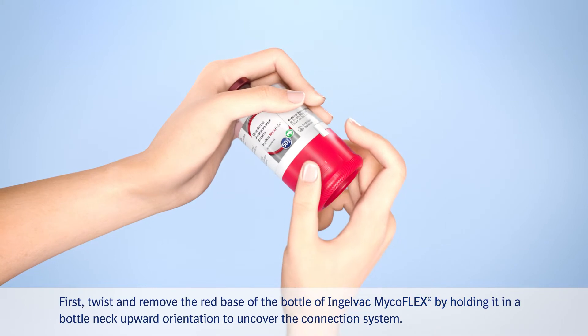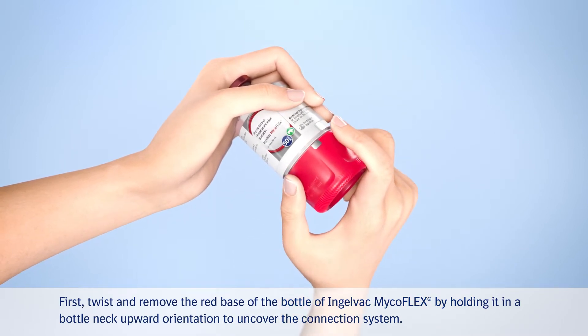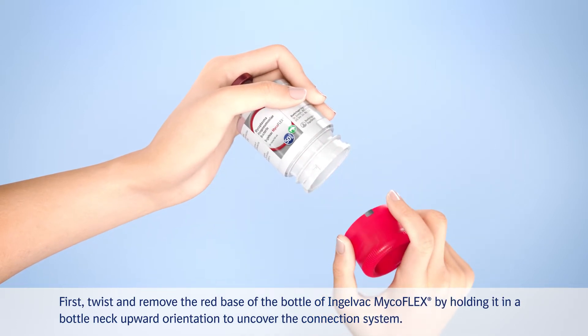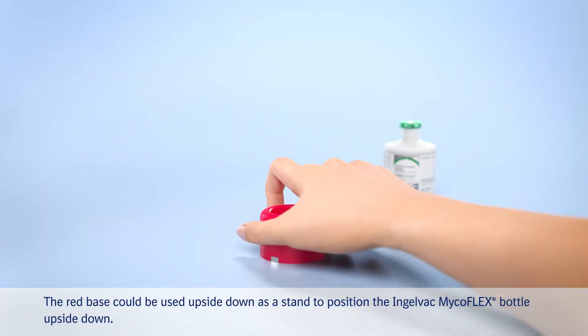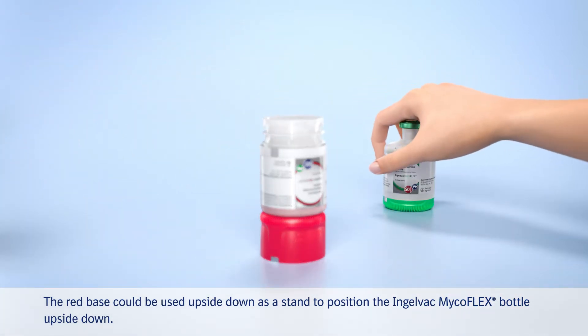First, twist and remove the red base of the bottle of Ingelvac MycoFLEX by holding it in a bottleneck upward orientation to uncover the connection system. The red base could be used upside down as a stand to position the Ingelvac MycoFLEX bottle upside down.